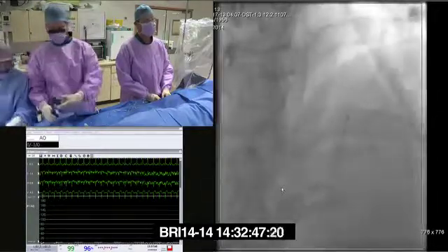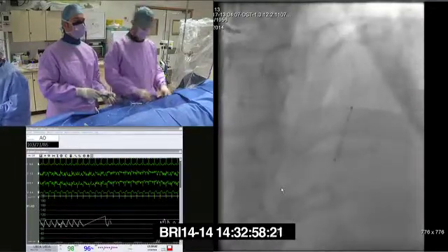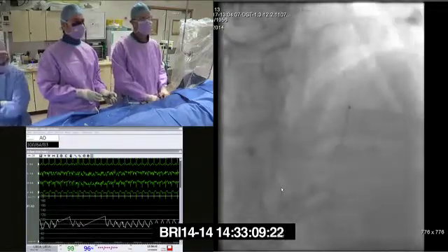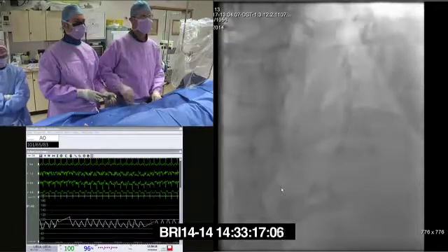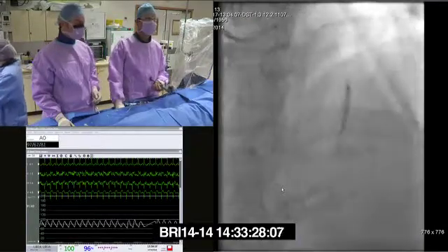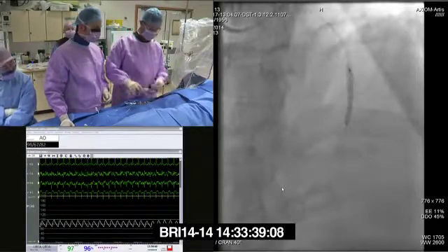Very craggy. Indeed, forwards, stop. So I've gone quite a bit further there. It's quite a craggy segment, that whole lot. Let's just go short to start. We'll have a little think. Let's just do that. So nominal 10 and rate 18. See, it was tapered down there as well. Just 10.